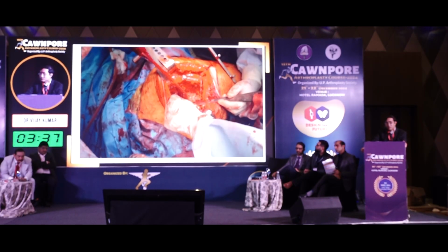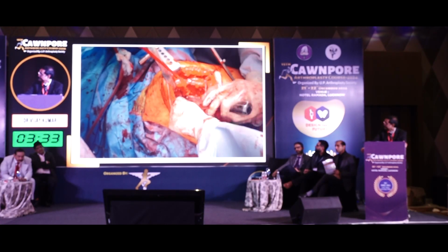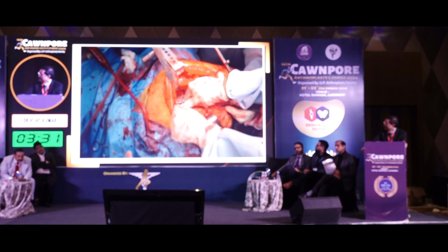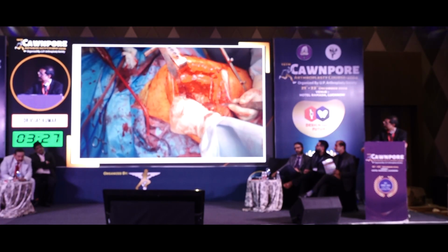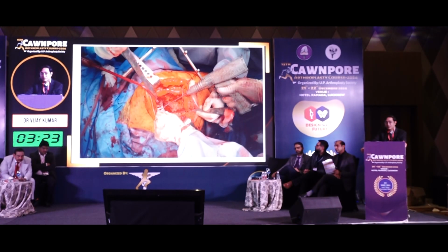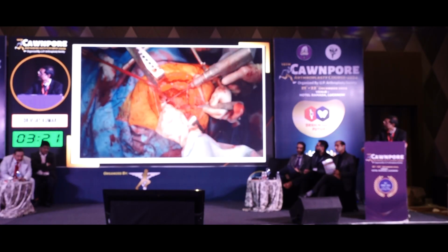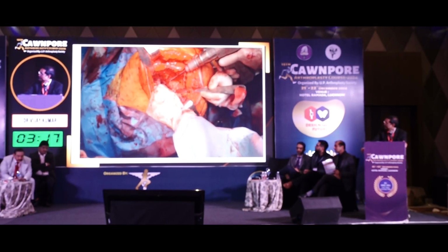So the first screw that you put is in the dome. Once you have that screw in, this cage allows you to put 4 or 5 screws in the acetabulum, and in the flanges there is another ability to put around 6 or 7 screws. So this is the screw which is being drilled for the first screw. This is the most important screw.